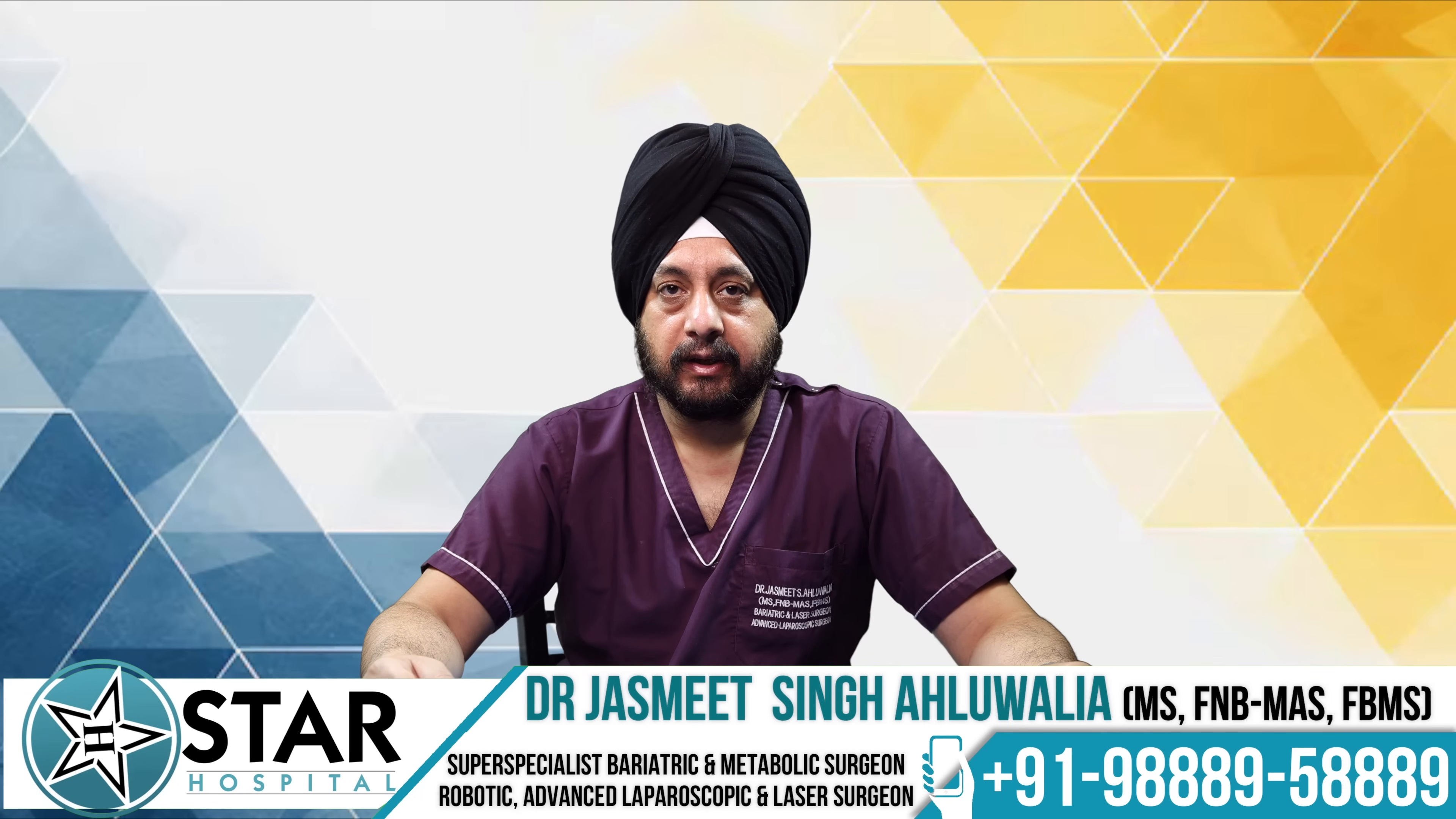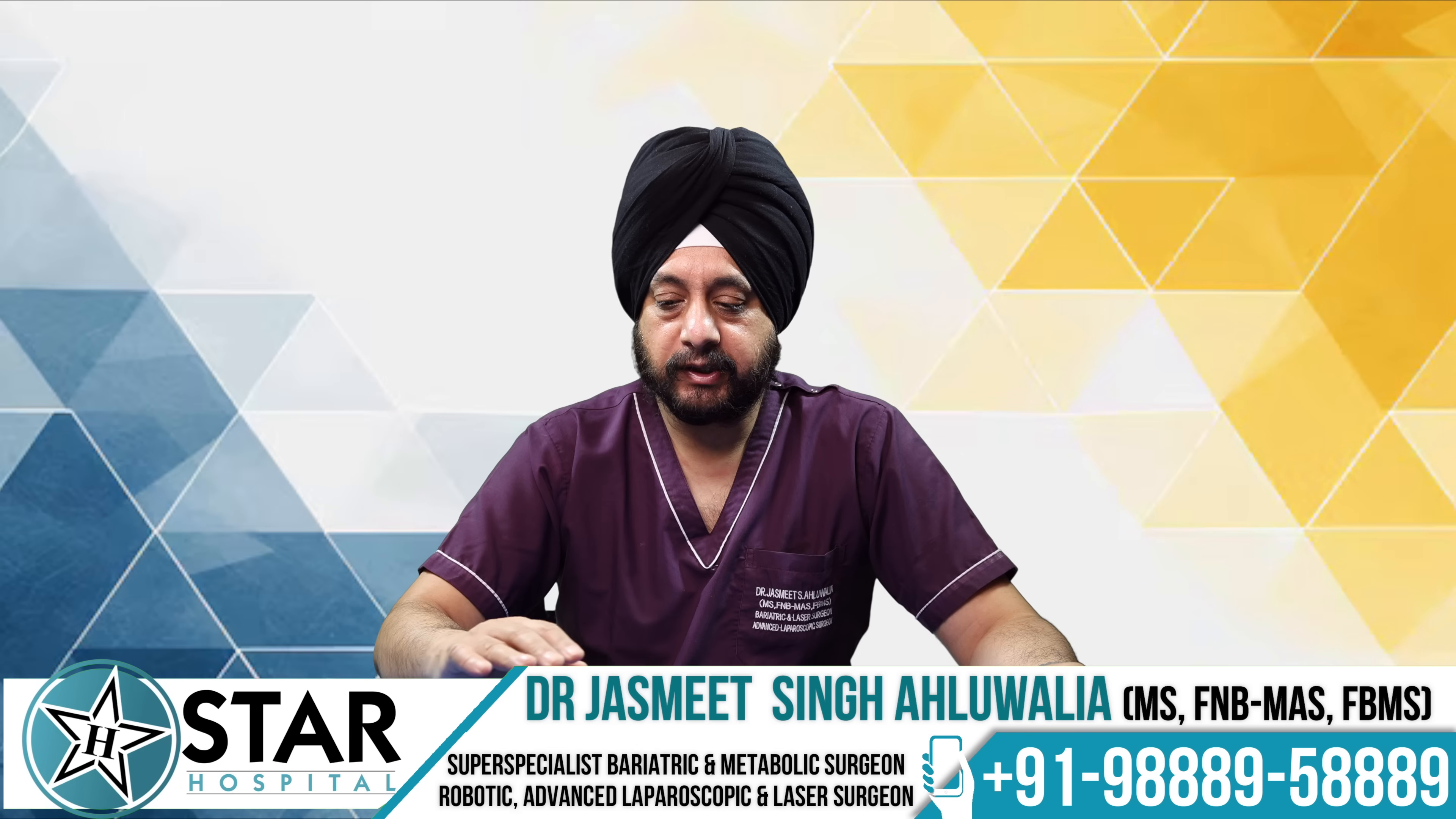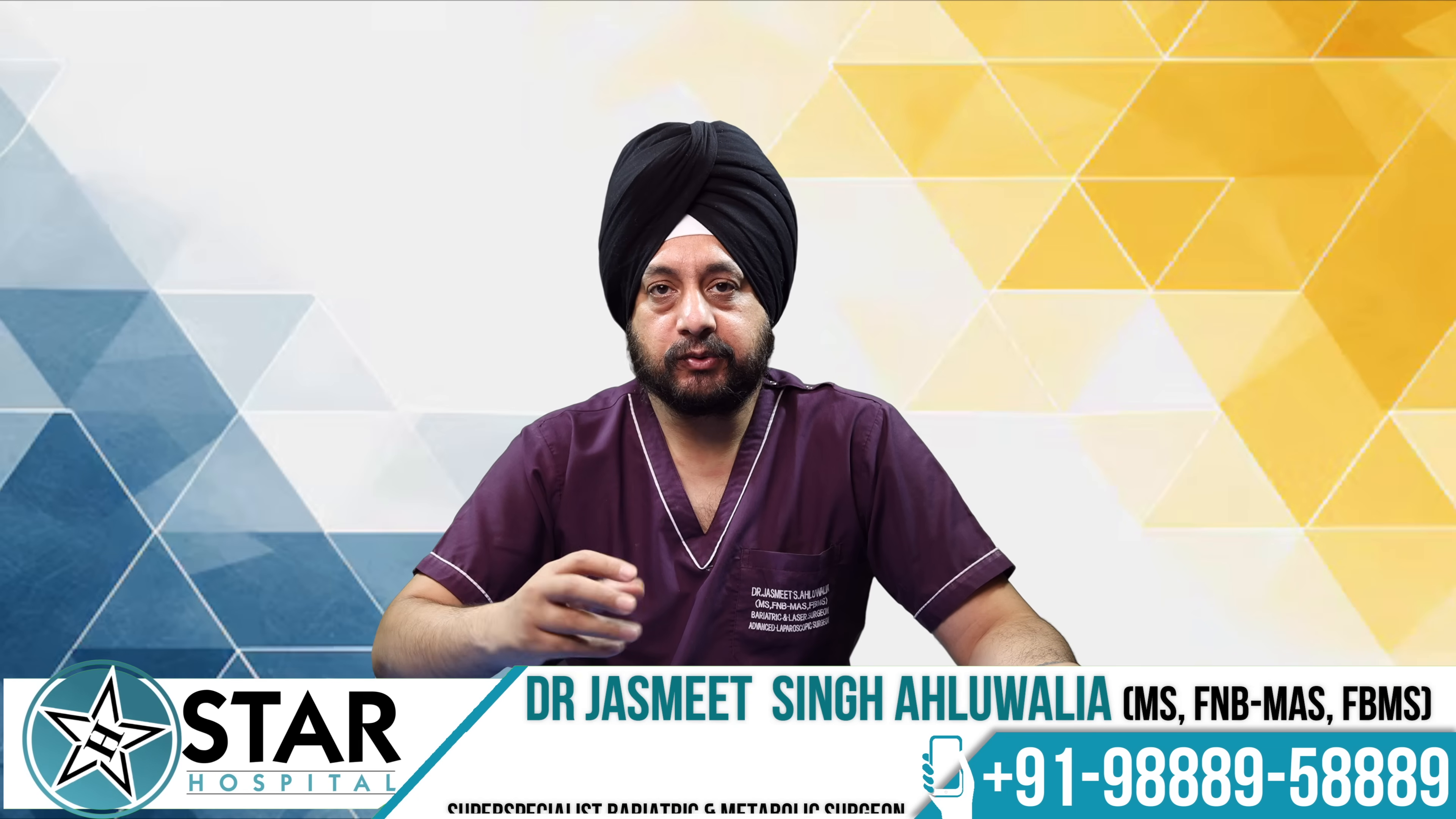Where to use which kind of scope? Ideally we should have the best image possible inside the abdomen. When you do not have a limitation regarding an incision, you should use a 10 mm scope so that it carries the maximum amount of light that can go inside.